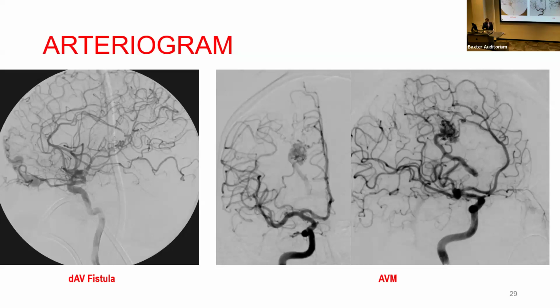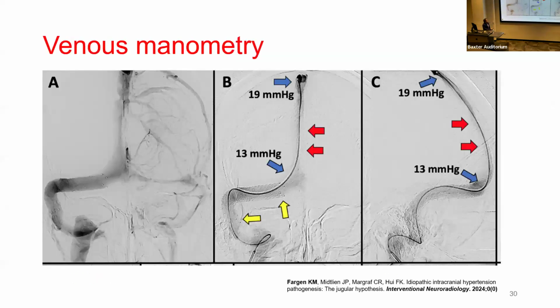and we can see the sinus there. But the most important part for us, even if the patient has stenosis, is to make sure that there is a difference in the pressure between the distal vein, this is the superior sinus, and the proximal area. We call that the gradient, so basically the difference between the pressures. This is a patient who already has stenting. So you see the stent is here, but you see the gradient was higher before and now it's better.